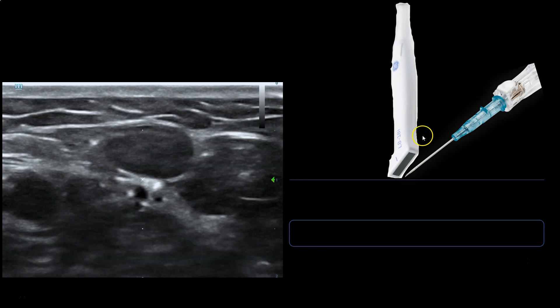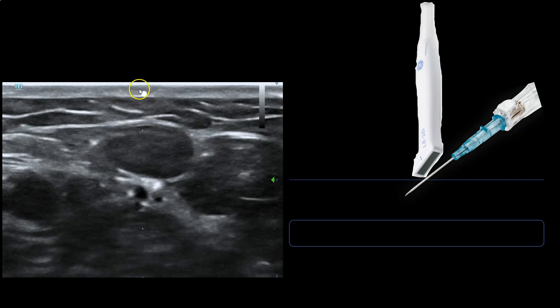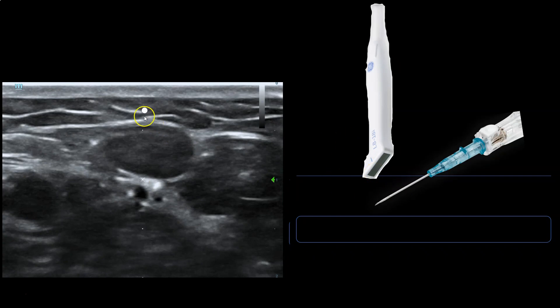Here's how the technique works. You're holding the probe in your non-dominant hand and a needle in your dominant hand. You've found a vessel, tracked it up and down, and confirmed it looks good. You've put a probe cover on, scrubbed the area with betadine or chloroprep, and put some ultrasound gel down. You pierce the skin with the needle, then stop moving the needle. Move the probe back until you see a dot on the screen — that dot is a piece of metal caught in the ultrasound beam, which could be anywhere along the needle shaft. You then move the probe forward until you just barely lose sight of the dot, then advance the needle a little bit further until the dot reappears.